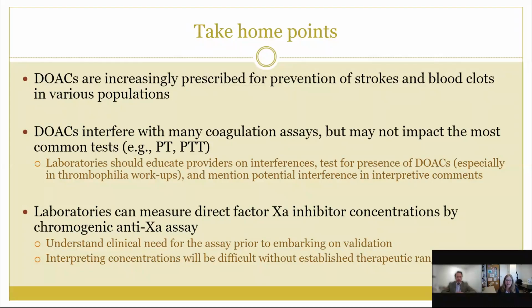You would need to go through and revalidate any performance metric of the test after using this product. A lot of it is left up to the discretion of the medical director, but in my laboratory, we would essentially revalidate the entire reagent after the use of those neutralization products, with probably some additional studies related to stability and some other things.